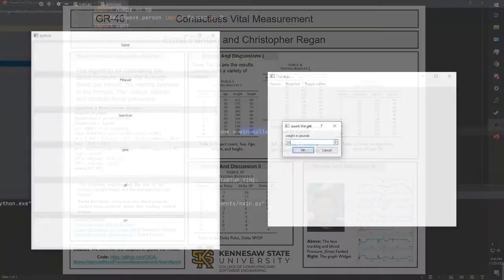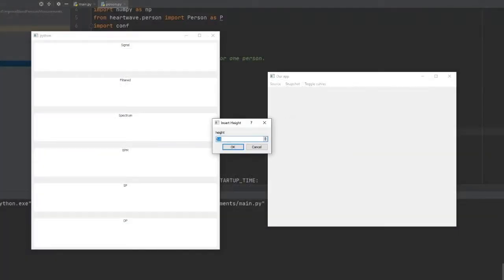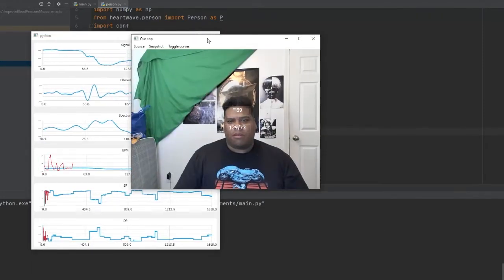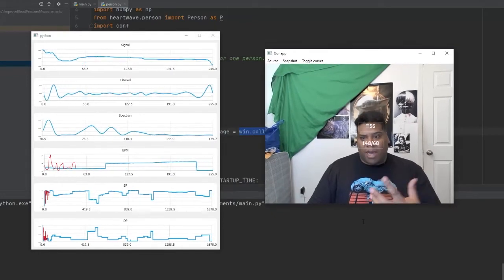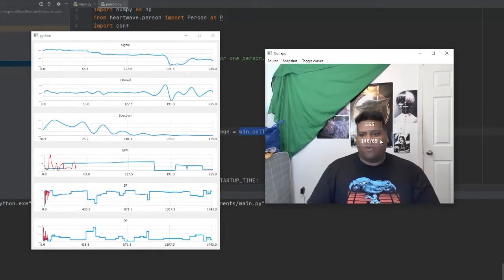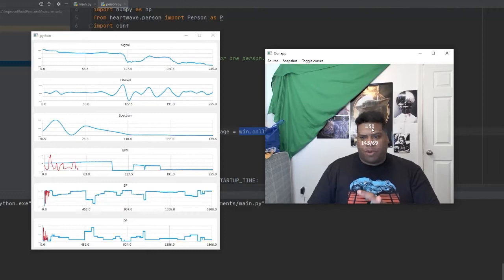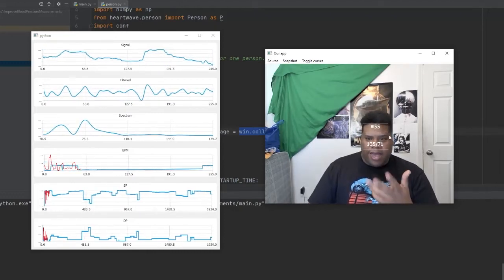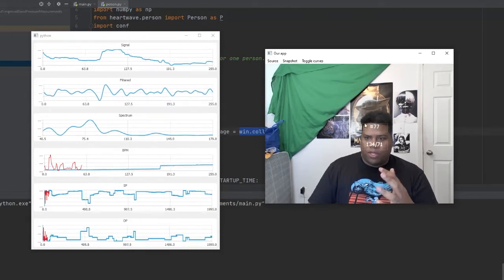So we were able to integrate into a pre-existing system the ability to ask a user, when a face is detected, their age, weight, and height. In the pipeline you can have multiple users displayed on screen, and then it would ask them individually for their age, weight, and height during runtime. That bit of code took a while to get incorporated properly into that system, so we did a lot of work on presenting a UI element to the user.